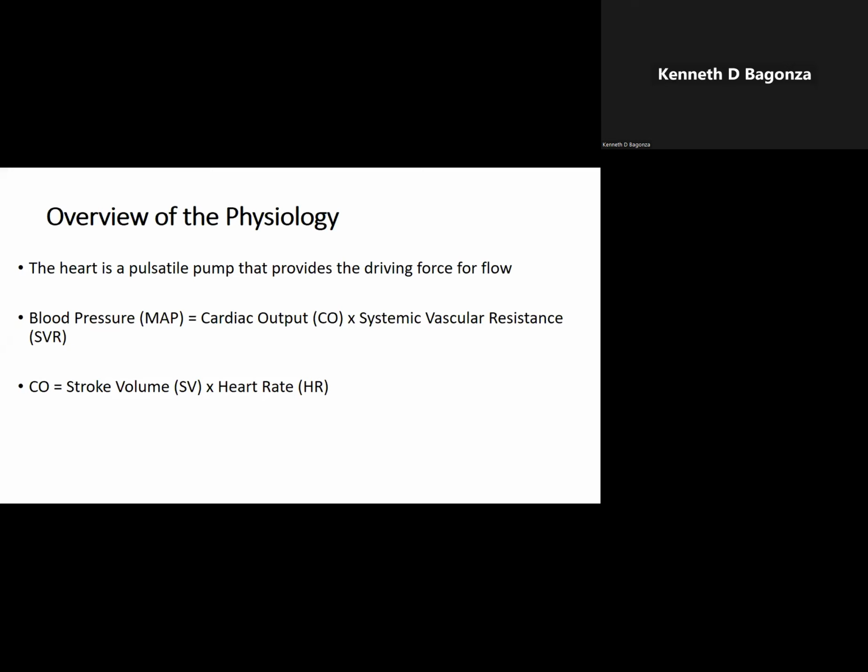Commonly, it can be myocardial ischemia or infarction. So when you do a 12-lead ECG, you try to see if there are features of myocardial infarction or myocardial ischemia. So that might be something that requires a bit of a deep understanding of an ECG, but the initial priority is what is the rhythm, and then you can have other people look at it and say, okay, is there ischemia, is there infarction, and we need to do something about it.